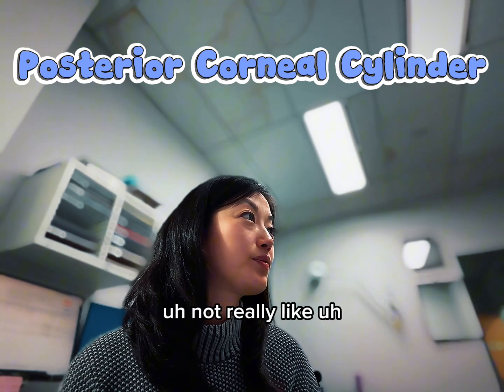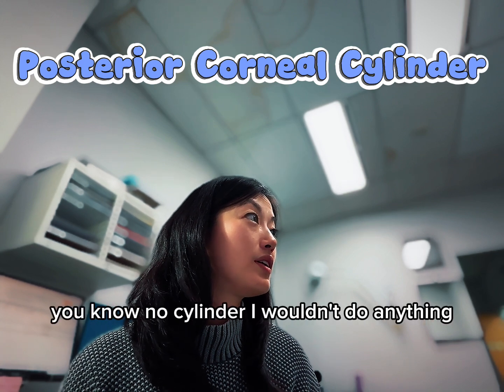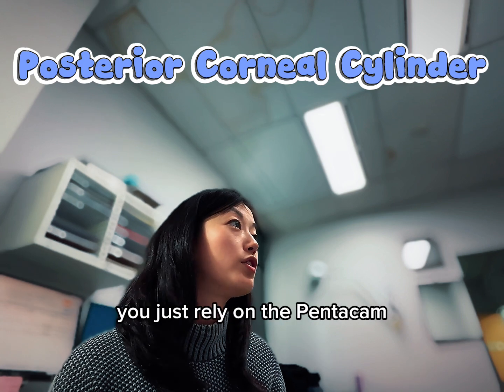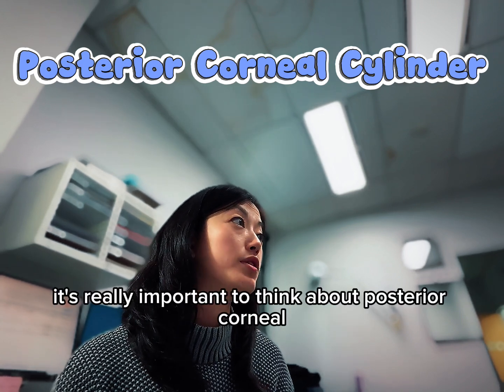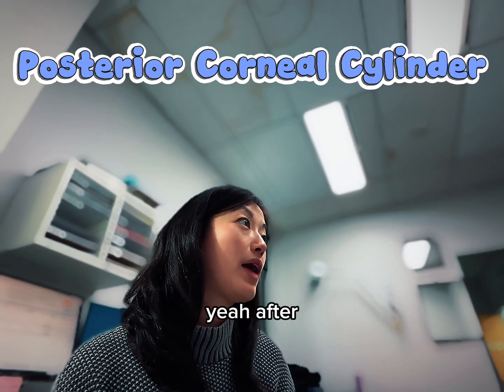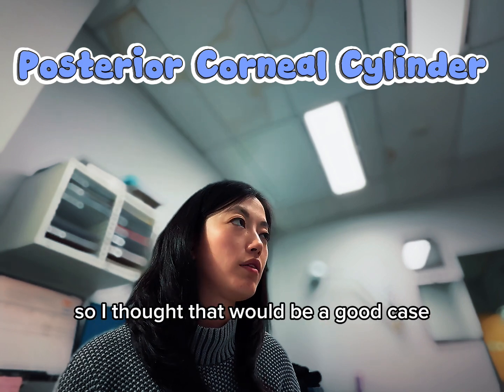Not really. Usually the Pentacam was flat, not flat, but like no cylinder, so that wouldn't do anything. Yeah, exactly. That's what, as a registrar, you rely on the Pentacam. But now it's really important to think about posterior corneal cylinder, because that can affect your result, especially after a multifocal lens, which is very sensitive. So I thought that'd be a good case to talk about.